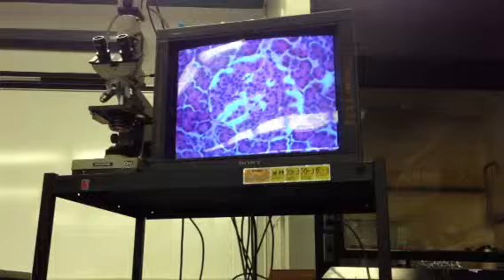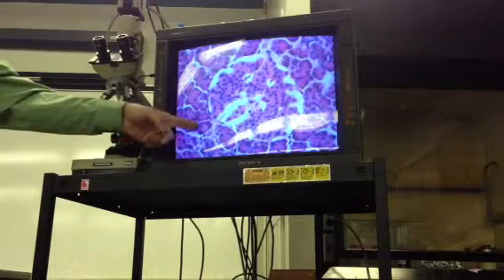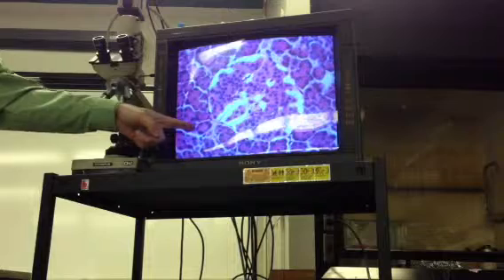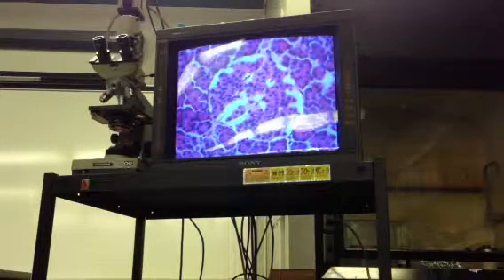You see the cells around the periphery, like a pizza where all the pepperoni is near the crust. That's the way I start to explain things when we get close to noon. It all becomes food.